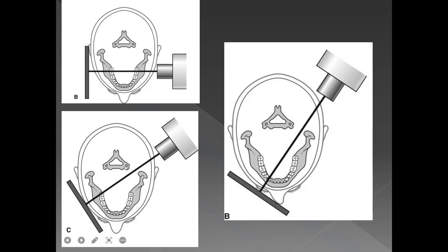So look, this is the cervical spine. And this is the ramus, and this is that area. This is that radiographic keyhole that I was showing you earlier. So you fire an X-ray through that, and you will be able to map the molars, the coronoid, condyle, ramus portion quite clearly. All right. And you won't have any superimposition from the other side over here.